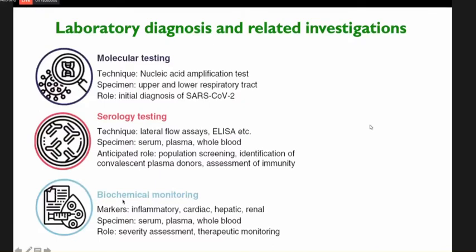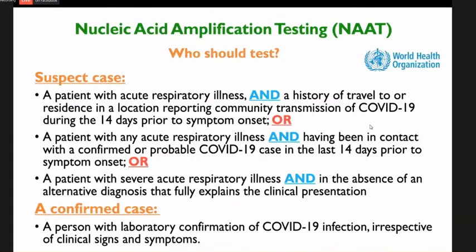And finally, also routine biochemical, hematological, and immunochemical laboratory testing is essential in assessing disease severity, selecting appropriate therapeutic options, and monitoring treatment response. So first of all, let's talk a little bit about nucleic acid amplification testing.